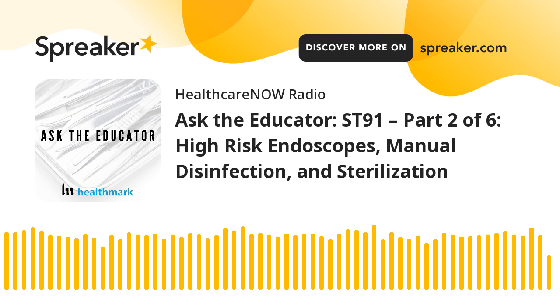So that's a big thing in your off-site locations, physicians' offices, ambulatory sites, more rural, less volume type facilities where they're still doing this manual soaking to achieve high-level disinfection. This could have a great impact. So we do still recommend that you have the ability to do that more on an emergency basis, but on a routine basis, you should be using an automated endoscope reprocessor, an AER, to achieve high-level disinfection.